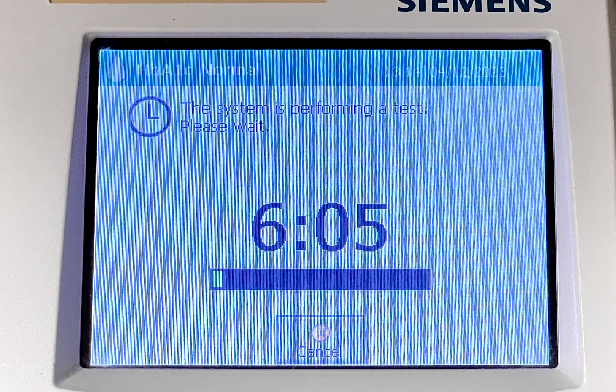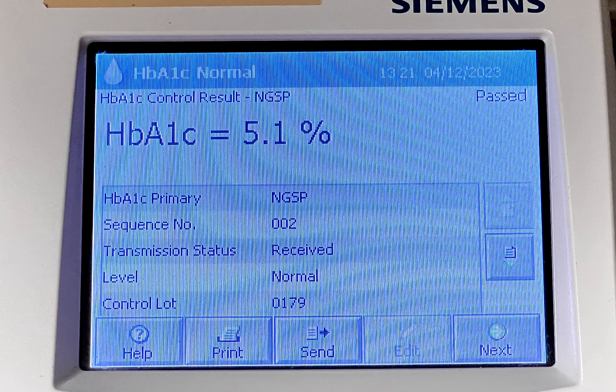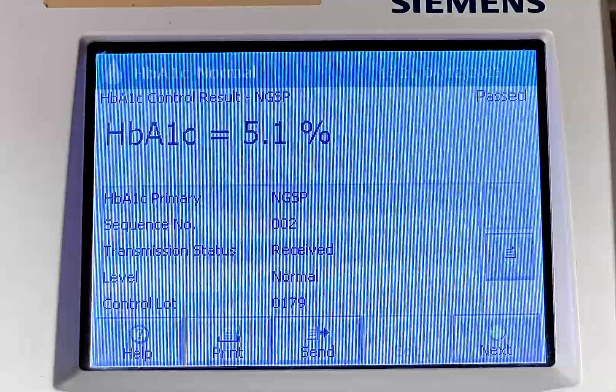The test will take about 6 minutes to result and pass. The normal result will show when the test passes. Click next.